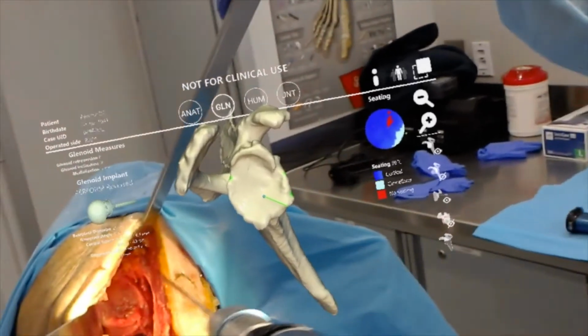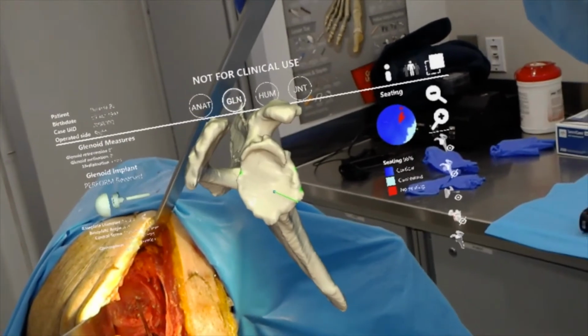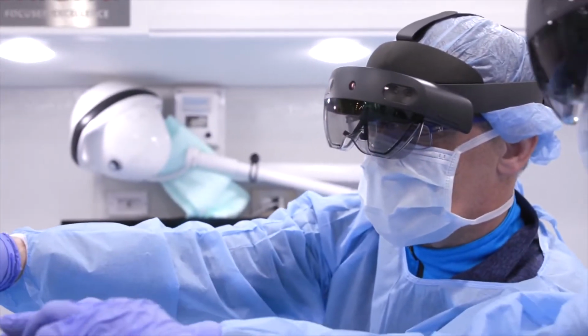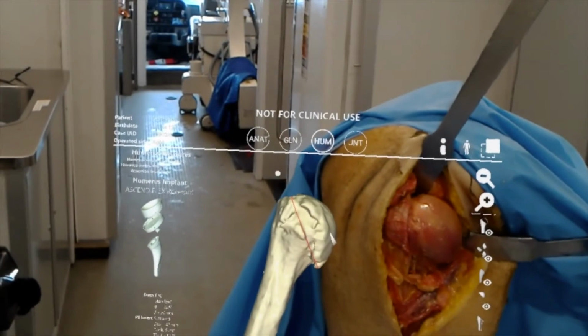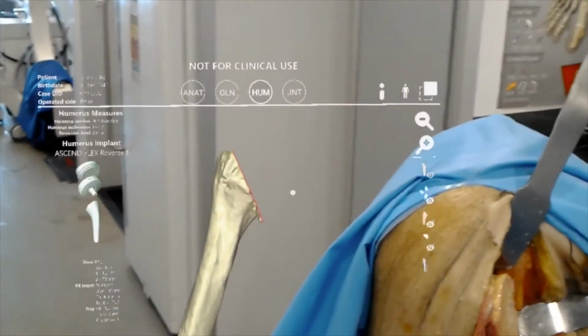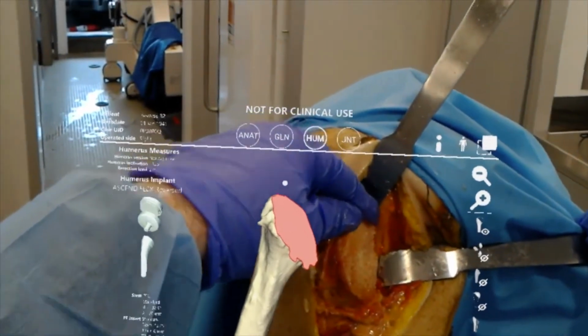You can move in space the image that you're going to reference for your operation. If it's distracting, move it out of the way. When you need it, move it where you want it. Rotate it where you want it. We can't see certain things from the field that we're looking at, and yet we can see the holographic view of what we want to achieve. The brain is interesting that way. It builds those data points and gives you spatial recognition you can't otherwise have just from imagining it.